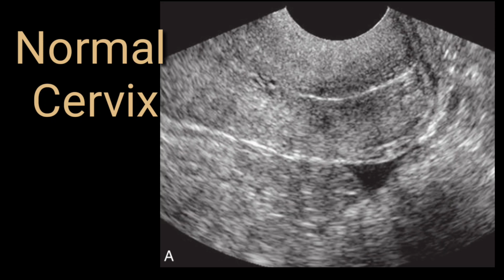Although you cannot appreciate internal and external os clearly until the patient is pregnant. In pregnancy, internal os evaluation is very important, which I will discuss during the obstetric scanning. Here you can appreciate only the entire length of the cervix, so you can measure this length as well. You can well indicate that the measurement of the cervical canal is that much, so length can easily be given on these images. Here external os cannot be accurately measured, although you can see it there.